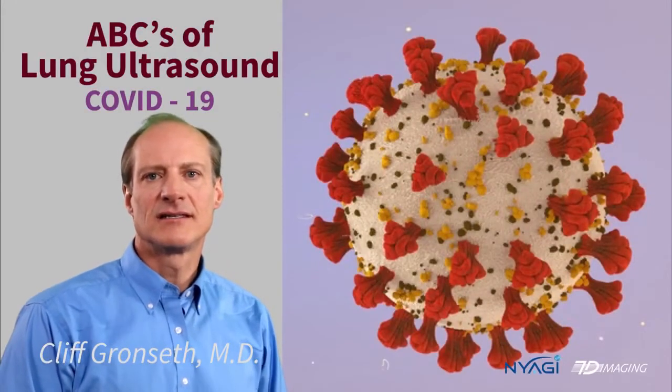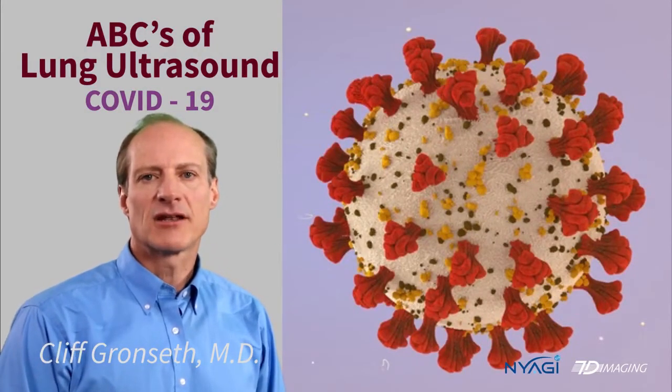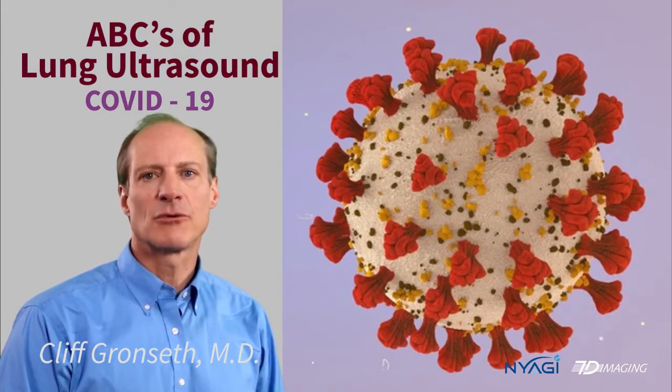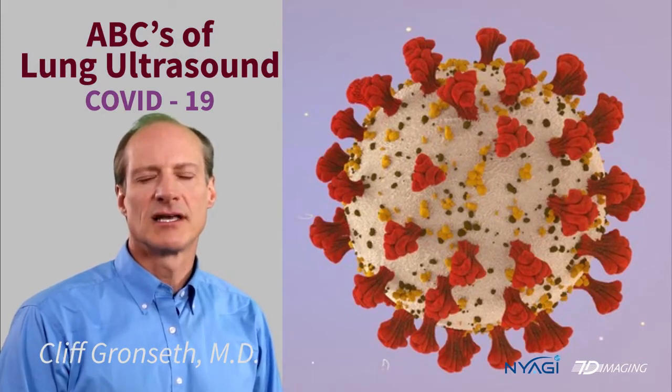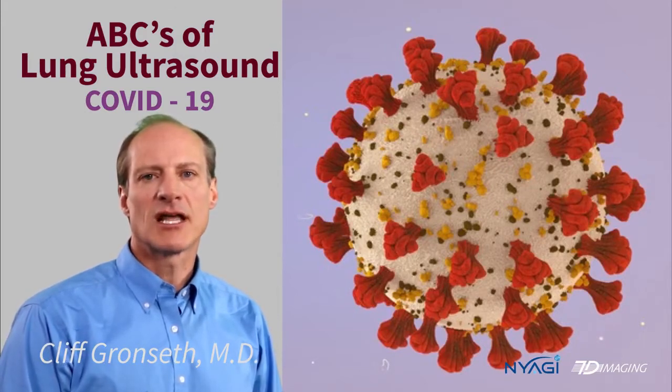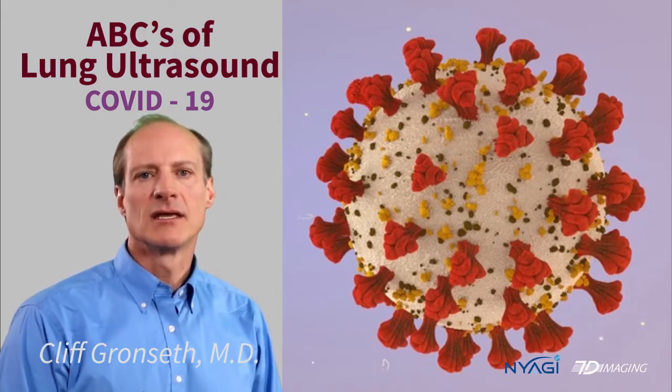Hi, this is Dr. Cliff Gronseth presenting an ultrasound video on the basics of lung ultrasound with regards to COVID-19 virus. As you know, COVID-19 is ravaging the world. If you have access to an ultrasound machine, lung ultrasound may be useful in helping with your clinical decision making. It's easy to learn if you know basic anatomy and ultrasound fundamentals.